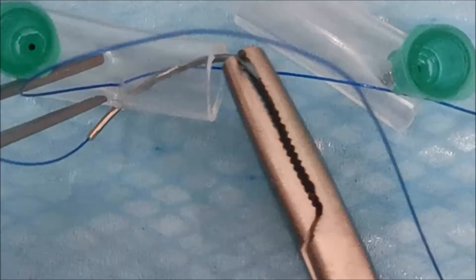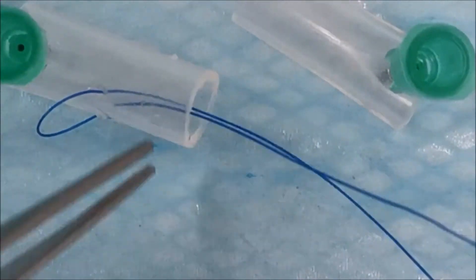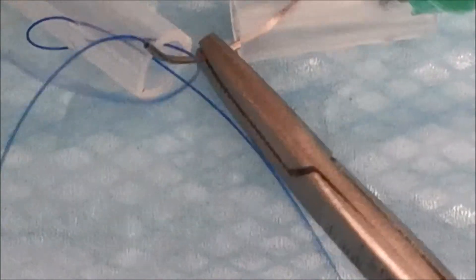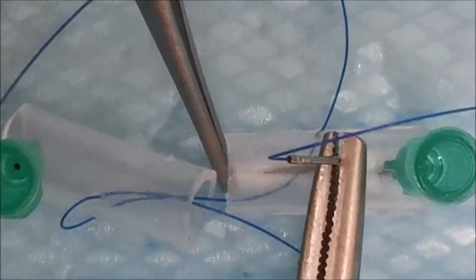It starts off the same but your second bite is an oblique bite going from the side of the tendon on one end on your side to the opposing side on the other tendon end.